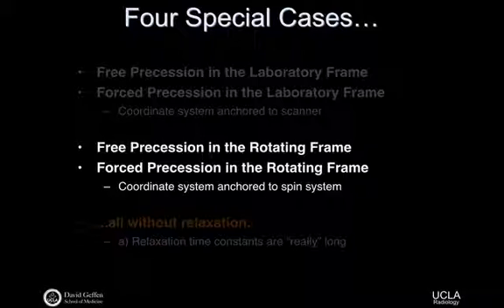Okay, so what just happened? What do we have as the final B effective? 0, right? So not a terribly interesting case. You guys probably got there before I did, right? So what's the point? Well, the point is that in the rotating frame, if all you have applied is the B0 field, there is no effective field. We've demodulated, gotten rid of, canceled out the effects or the apparent effects of the B0 field, right? We can use that now. That B effective can go back into that equation of motion and describe for us what's happening under those conditions in the rotating frame. Question?